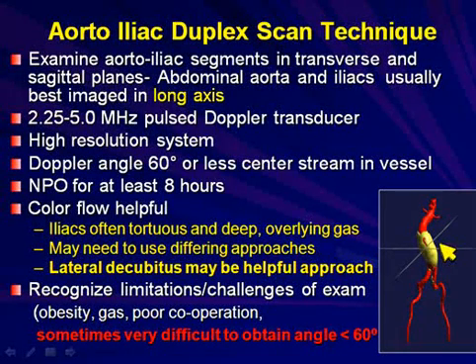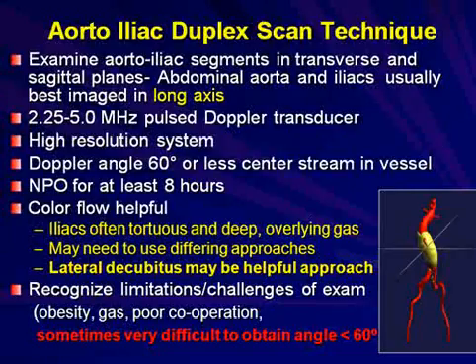You need to recognize that there are some limitations and challenges to this examination, obviously obesity, poor cooperation, and it is sometimes very difficult due to this tortuosity to obtain adequate angles under 60 degrees. So it requires some due diligence to do that.